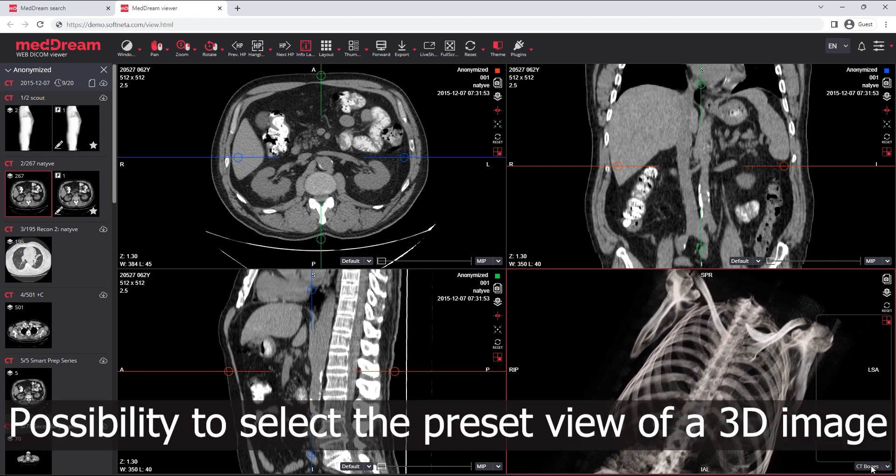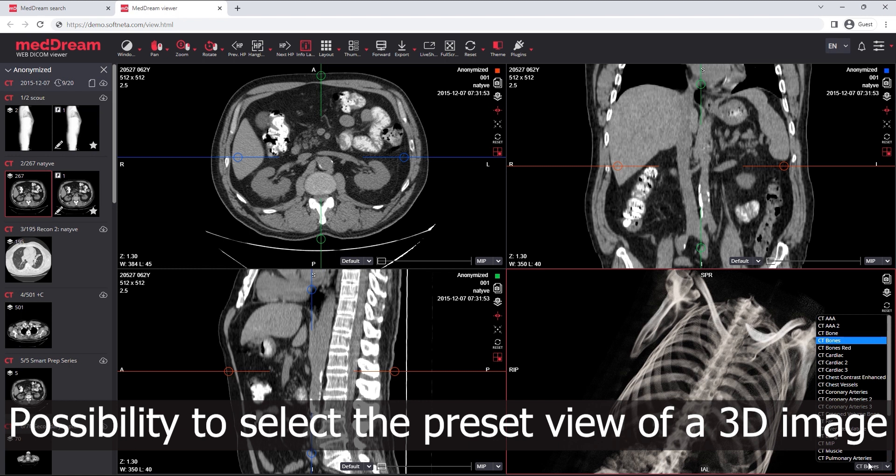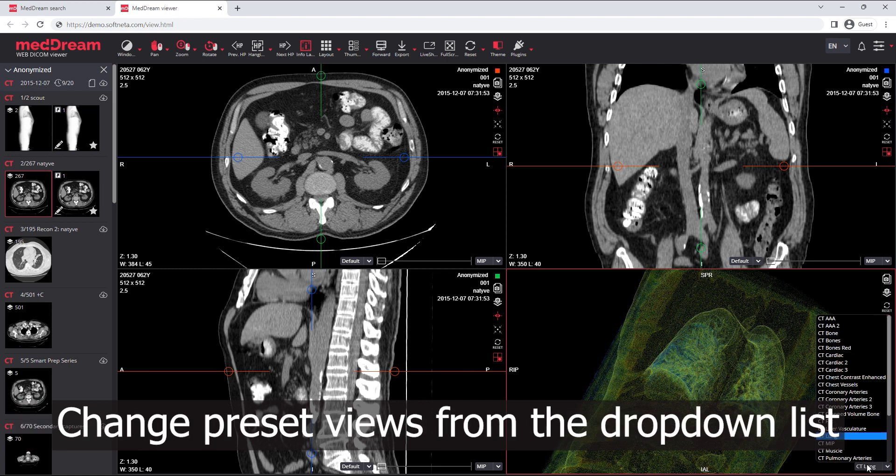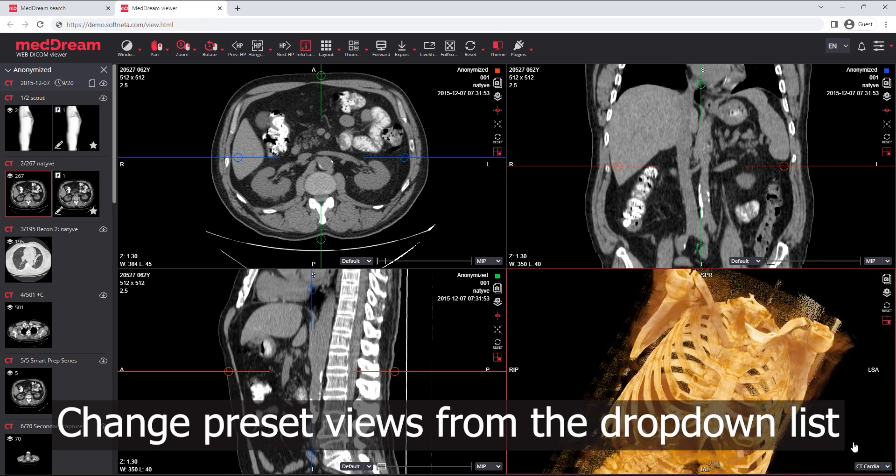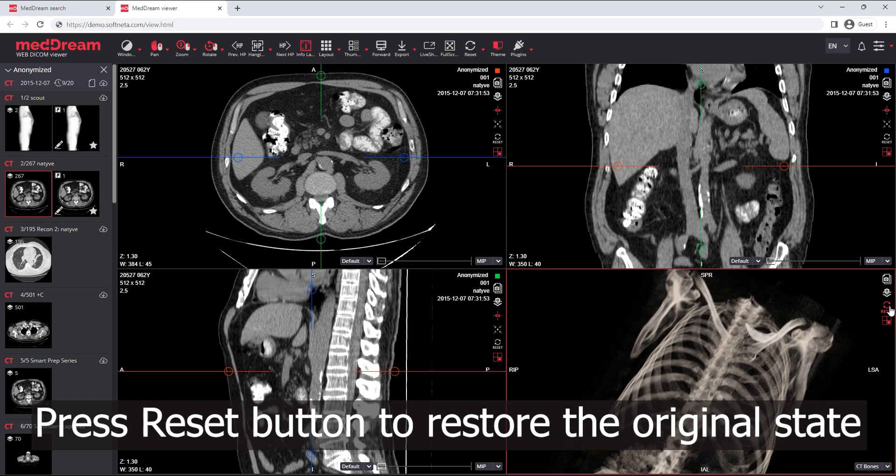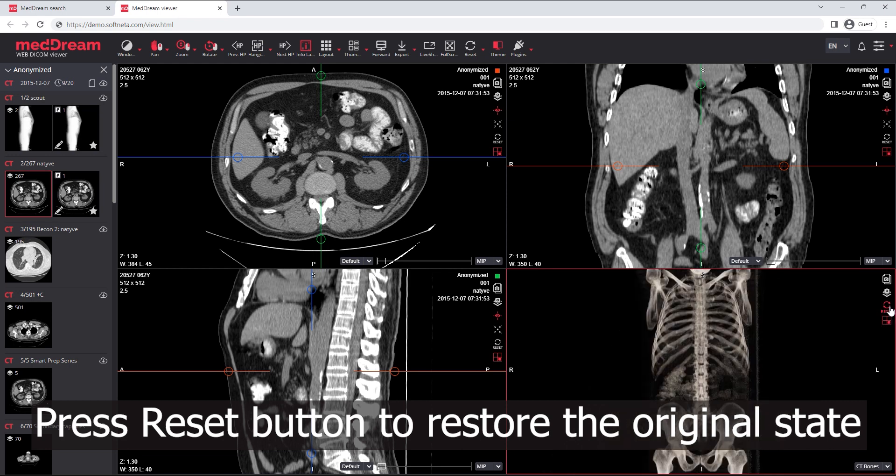Possibility to select the preset view of a 3D image. Change preset views from the drop-down list. Press the reset button to restore the 3D image to its original state and restore the layout.